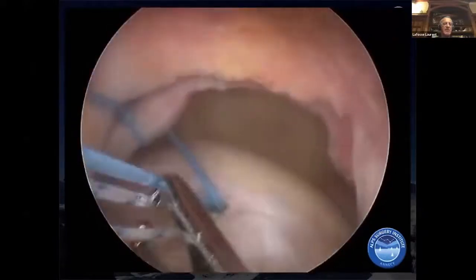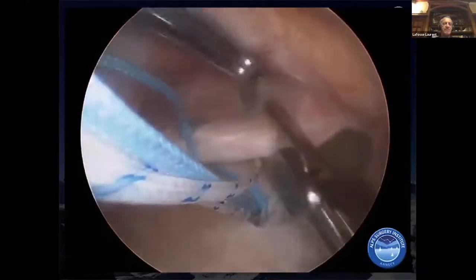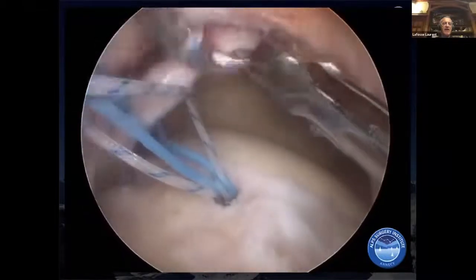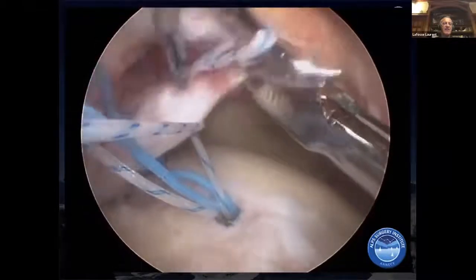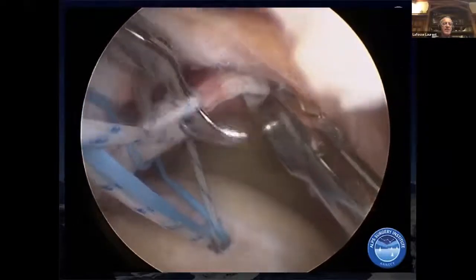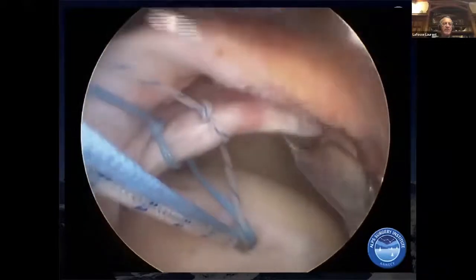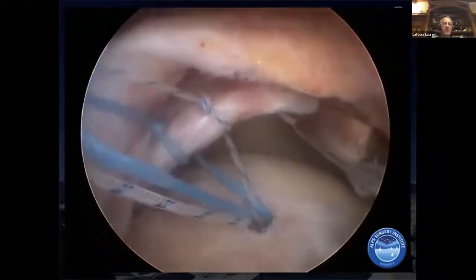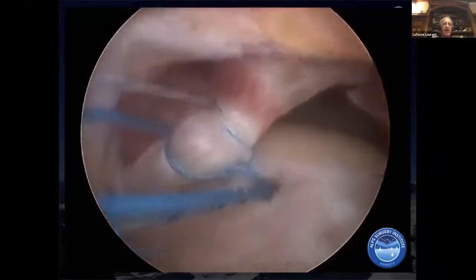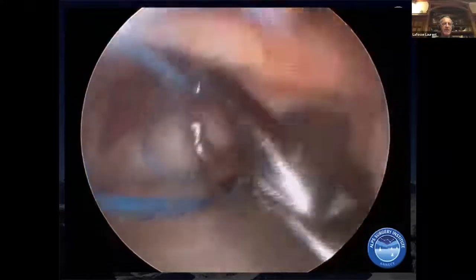And you will see that I'm using the two threads of the anchor differently. This anchor has two sutures, and each suture has two threads. So I use one of the two threads to manage the lasso of both sutures, the blue and the white. Then I pull on the other one, like on a pulley. And I bring the deep layer back to its location here.